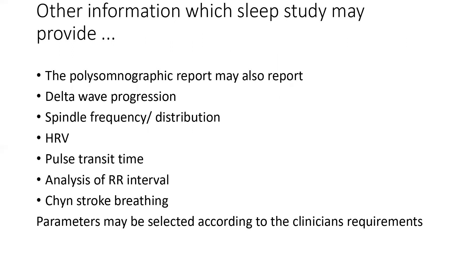A sleep study provides more than just those three or four parameters discussed. It is a more detailed analysis. If we wish, we can select channel templates that give analysis of delta wave progression, slow wave sleep data, spindle frequency and distribution — useful for research purposes — as well as heart rate variability during sleep, pulse transit time, RR interval, and Cheyne-Stokes breathing. According to the clinician's requirement and the patient's presentation, a lot of data can be analyzed from the sleep study, which definitely helps in making a better clinical diagnosis and leading toward more holistic management of patients with sleep disorders.